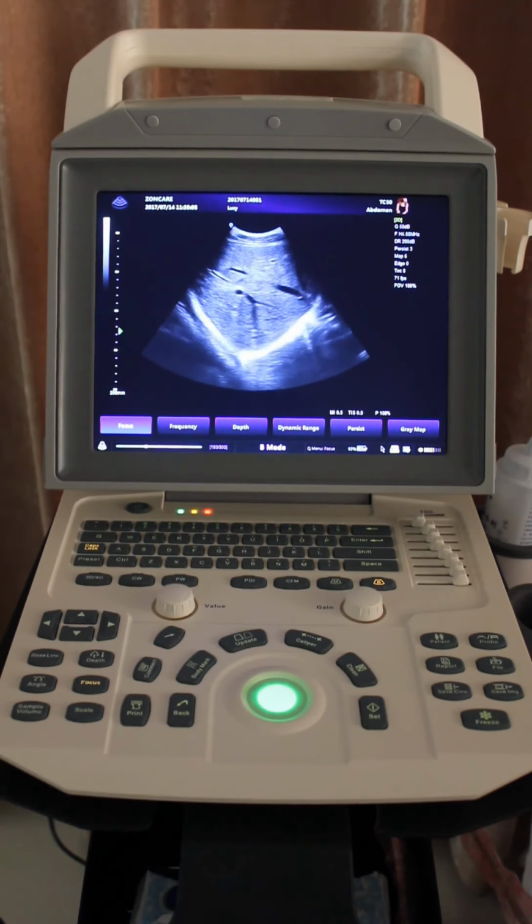If we want to copy any of the images to a USB device and then from the USB device to the computer, we can tick the images we want. Then we can see there are tools. We press the set button to the tools button, and we move to the copy tool.